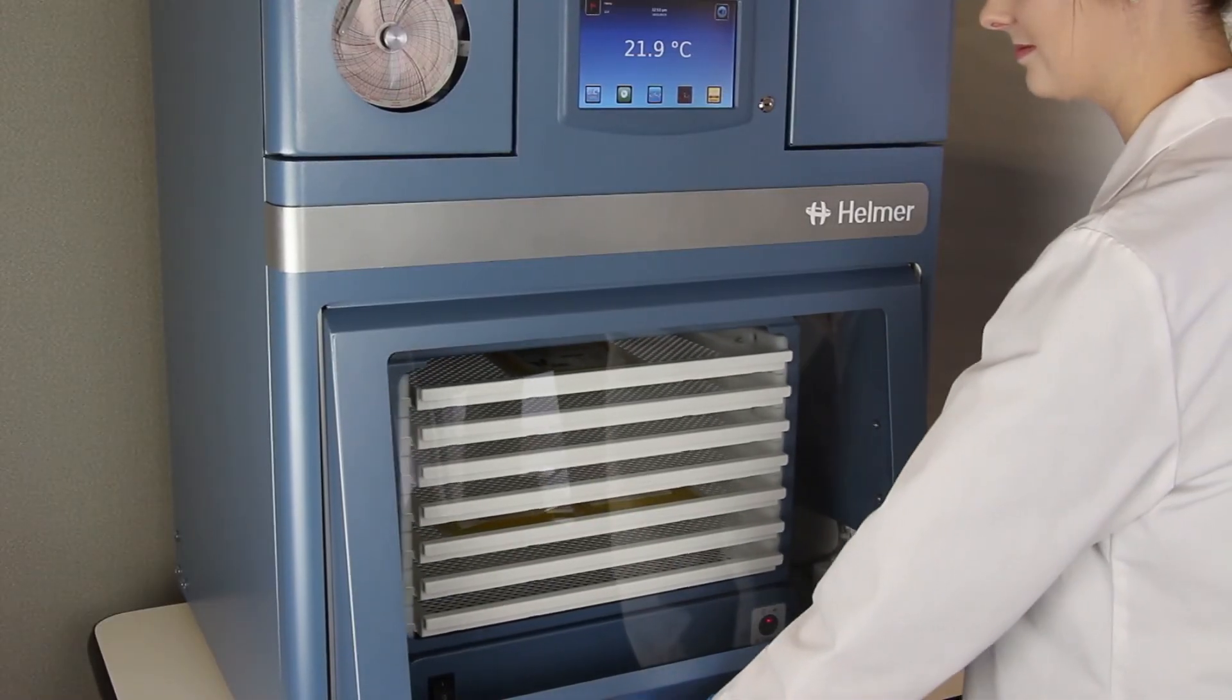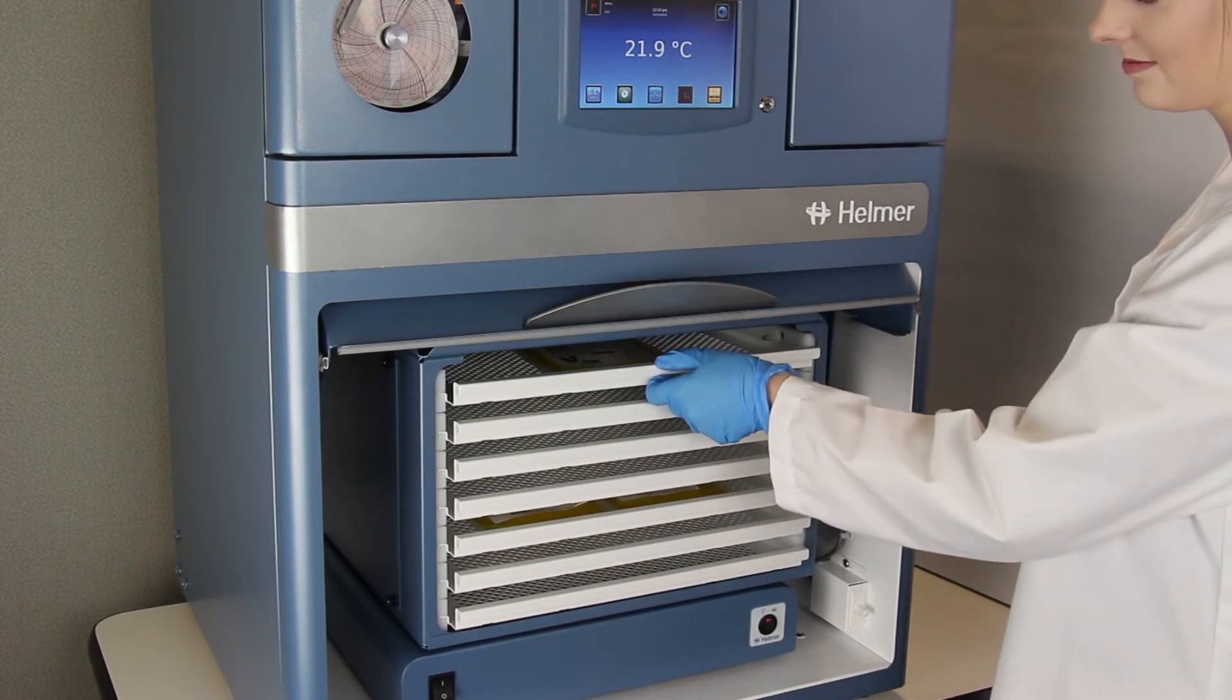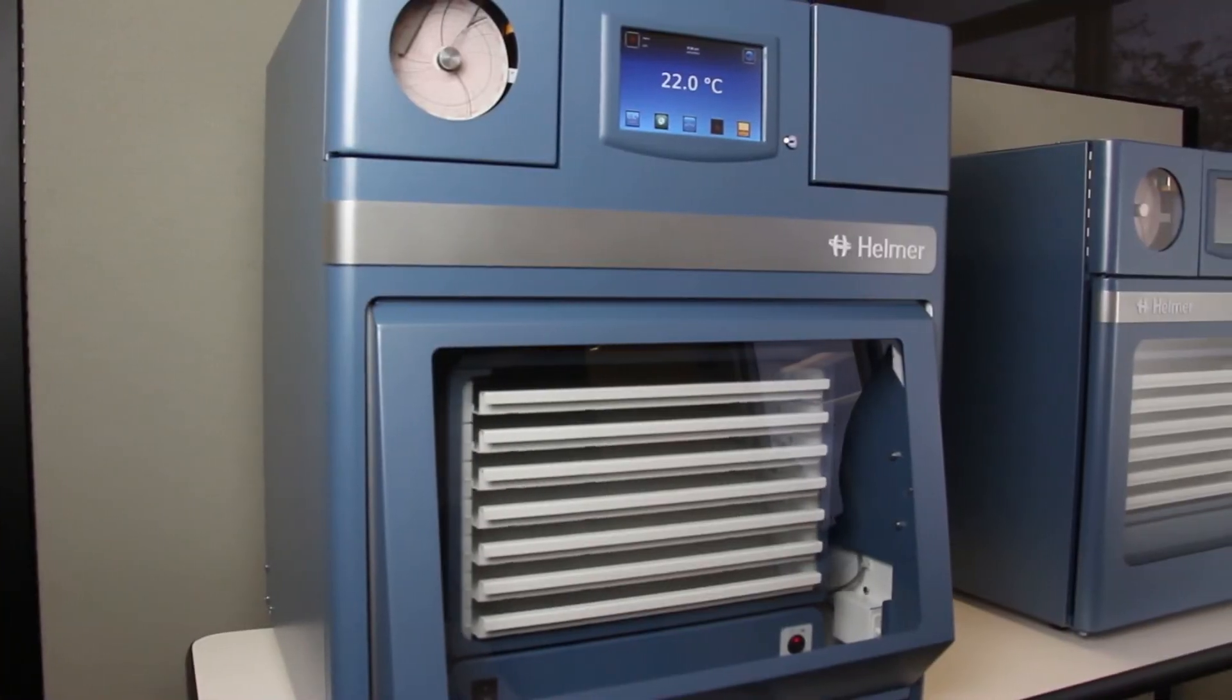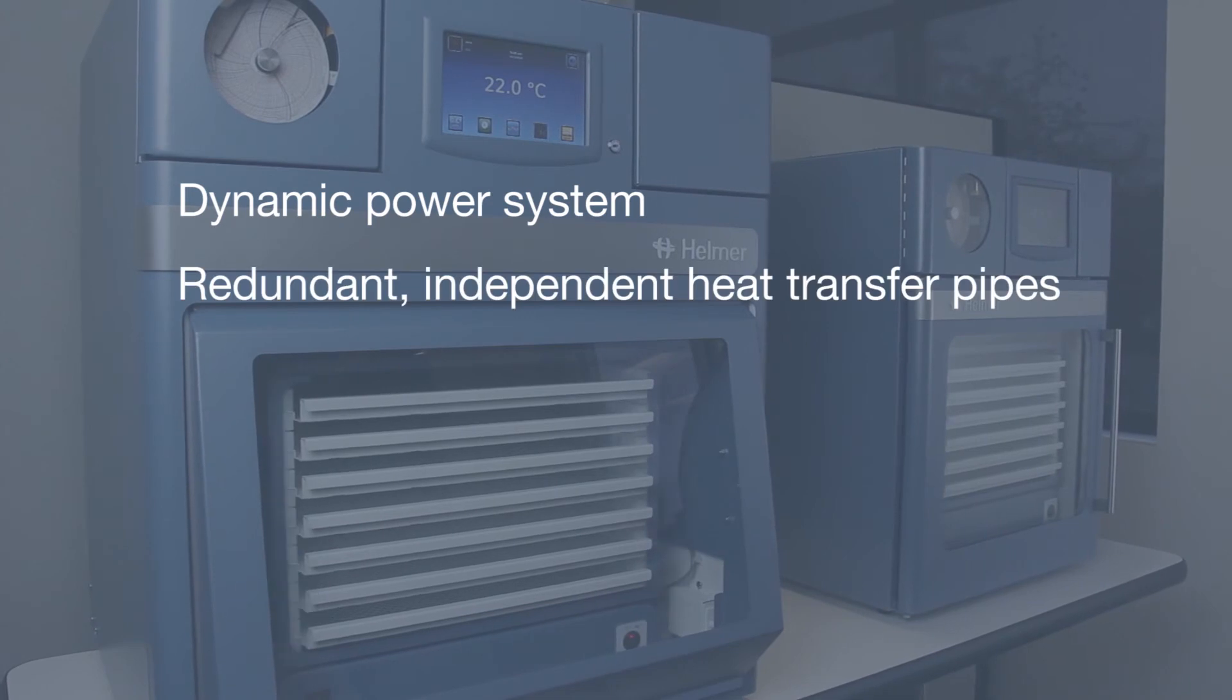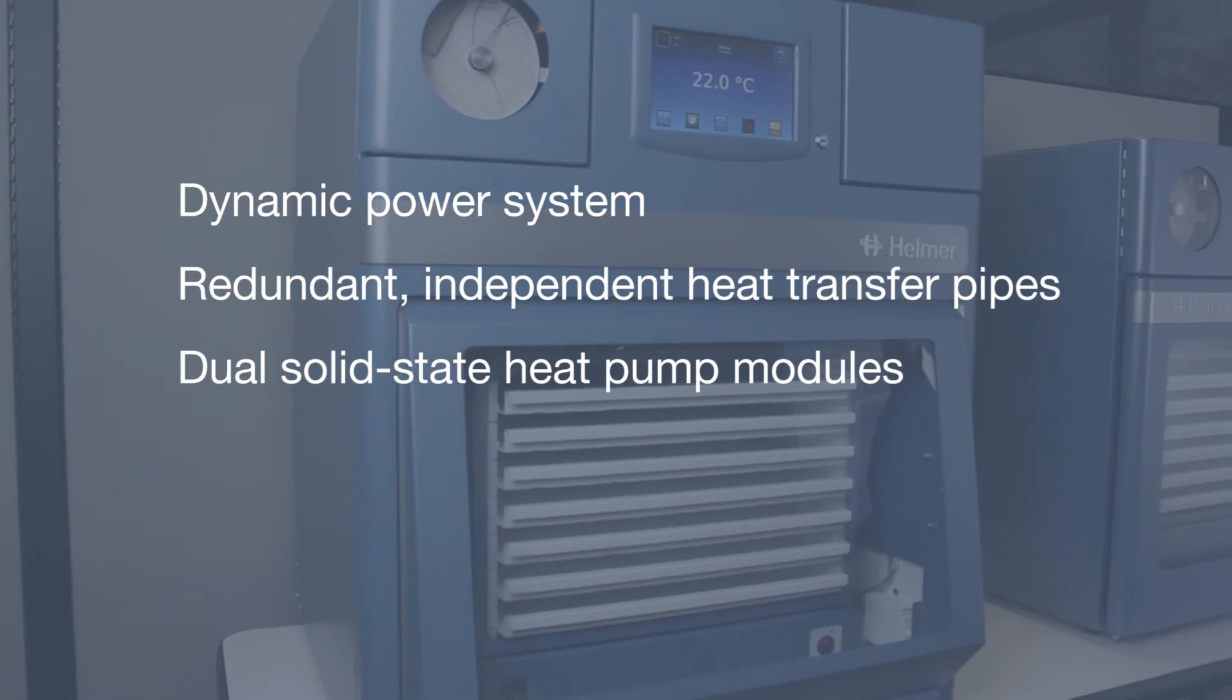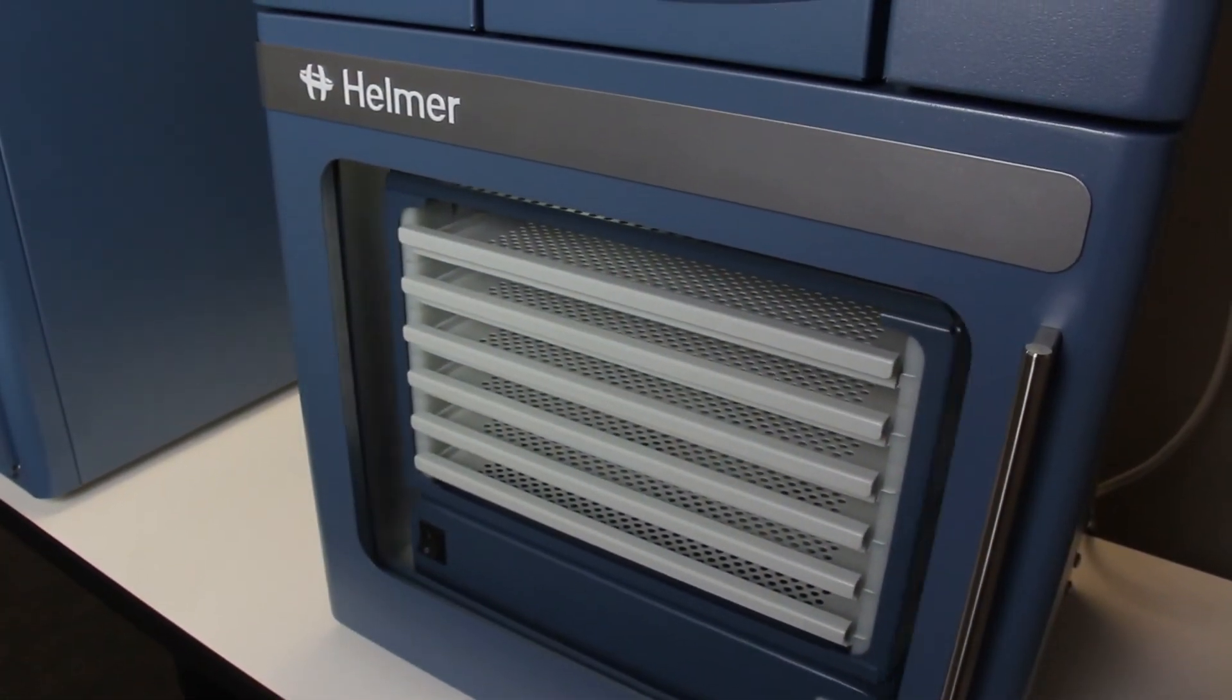Reliability is essential when storing valuable platelet products in terms of system performance as well as avoiding downtime and unplanned service calls. Advanced core leverages a dynamic power system, redundant independent heat transfer pipes, dual solid state heat pump modules, and dual exhaust fans to create a highly reliable product.